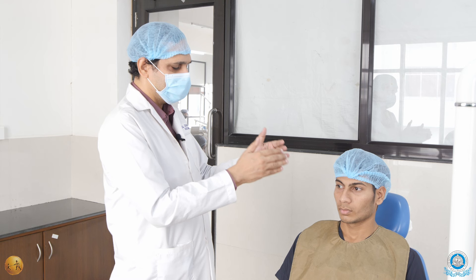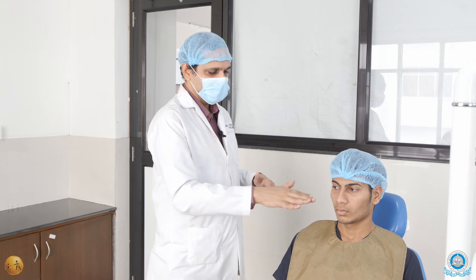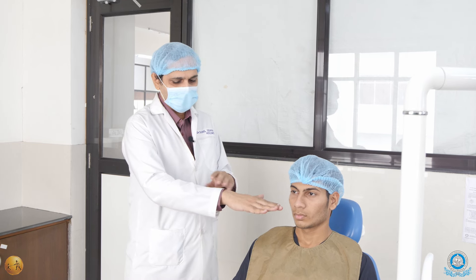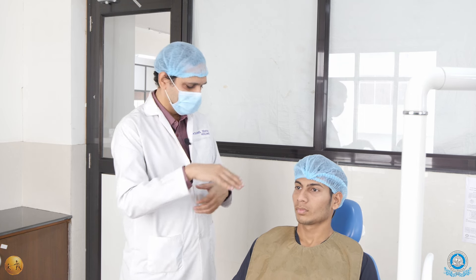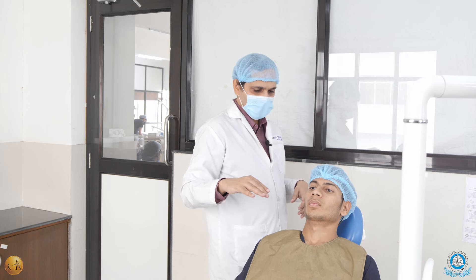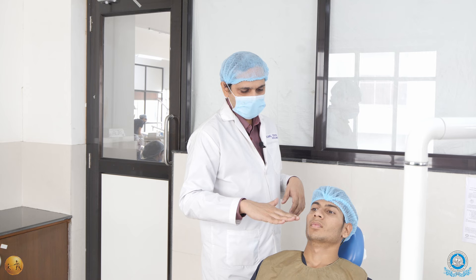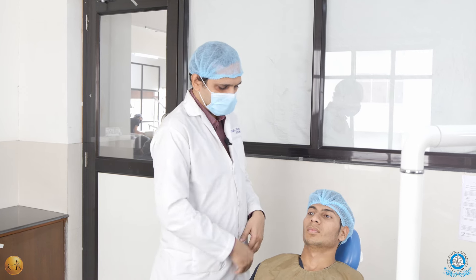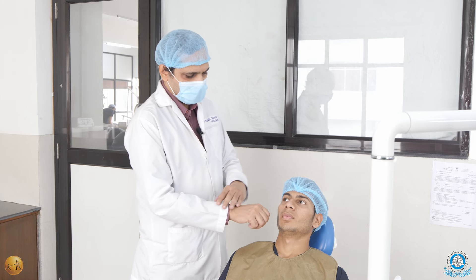The chair is slightly reclined, and for the lower arch you have to make sure that the lower arch occlusal plane is parallel to the floor, and at the same time it is at or below the elbow level — never above the elbow level. I will just lower the chair for you, so as I am standing it should be at the elbow level or below.